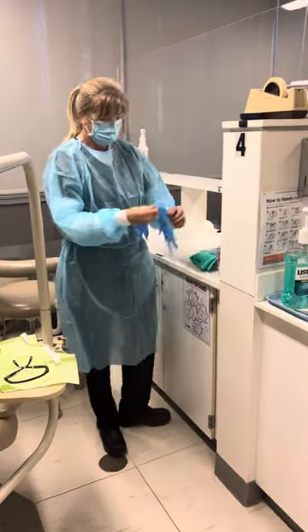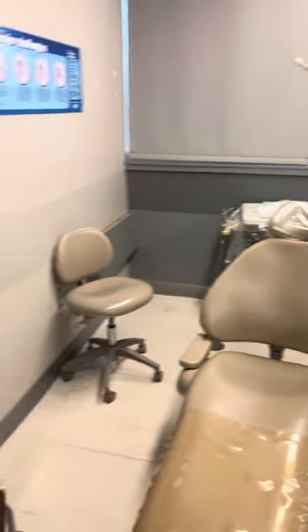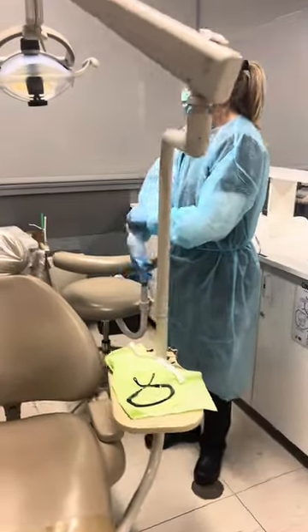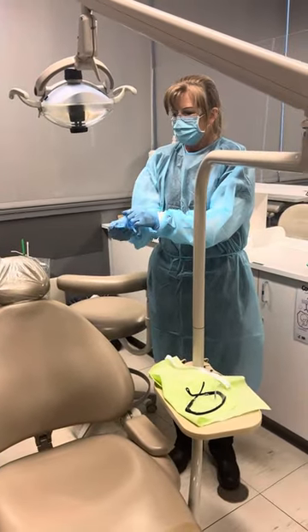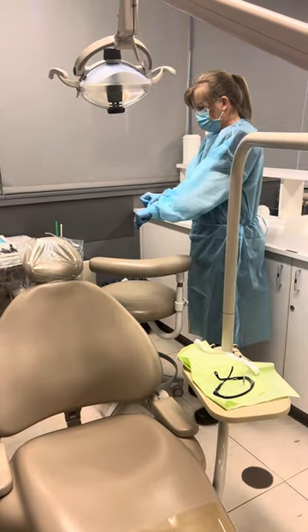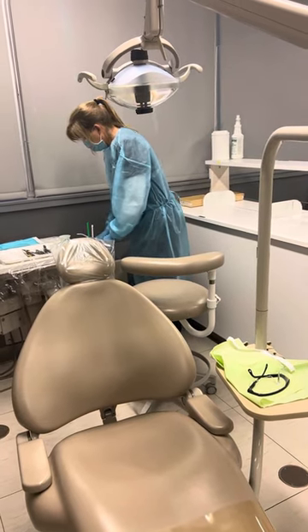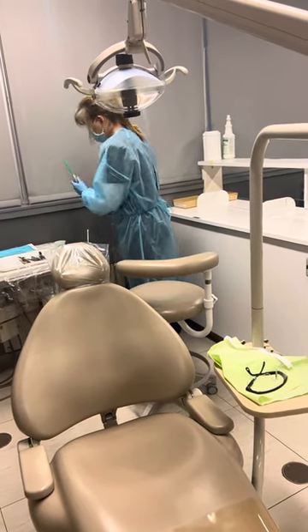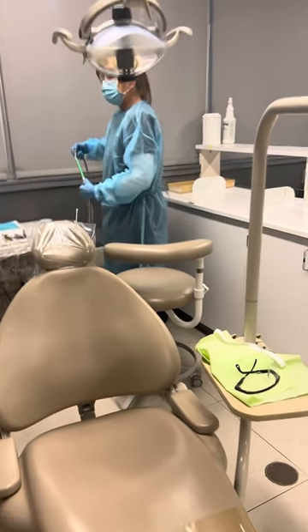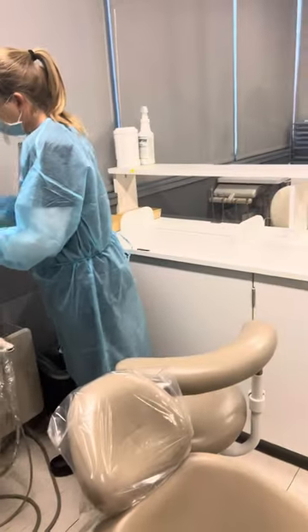She's going to glove up and now she's going to break down all the barriers and the tray that we used on the patient. The first thing to do is run your water lines so you don't forget about them. She's going to pick up her air-water syringe and run it in the HVE — just turn it on and run it.